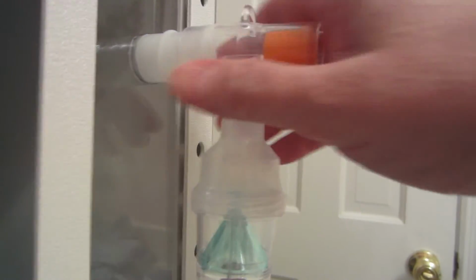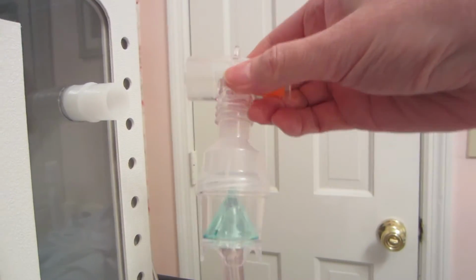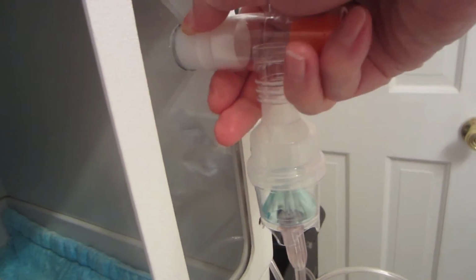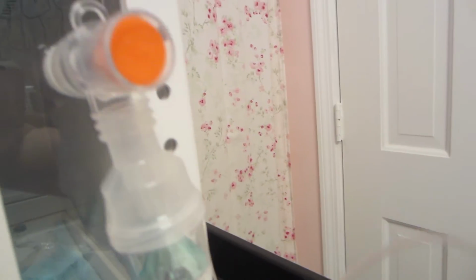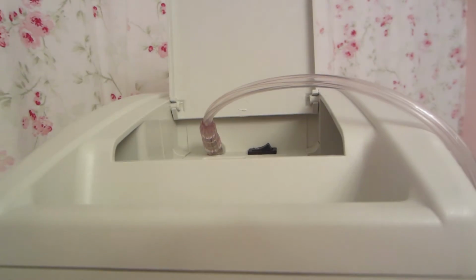So that is that. This is the actual nebulizer. That's this little doodad here, and it fits onto my little spigot thing. The medication goes in this bottom half, and we'll get into that in just a minute. So we have here the nebulizer, and we have our airline tubing, and it goes up to the compressor.